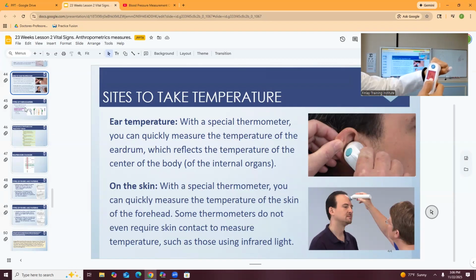Right now it's going to say low because we don't have it in the ear canal. But when this is done, then we are going to press, and that is going to take that sleeve out. We do not touch the sleeve. This is going to go directly to the trash and we push it, okay?